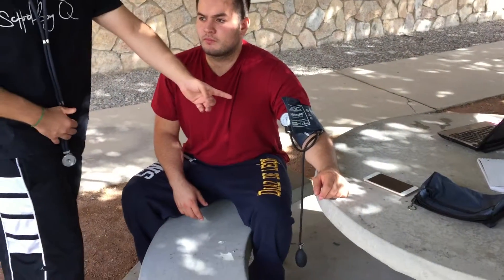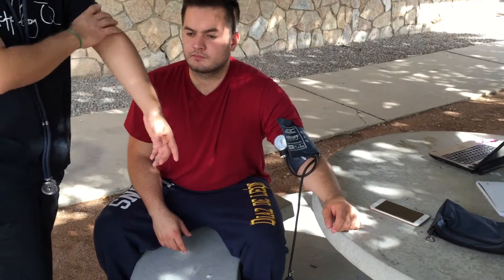When you take the blood pressure reading, you want to have their bare arm. As you can see right here, the blood pressure cuff is already wrapped around his bare arm. Now the way you take the blood pressure reading, there are going to be two sounds.